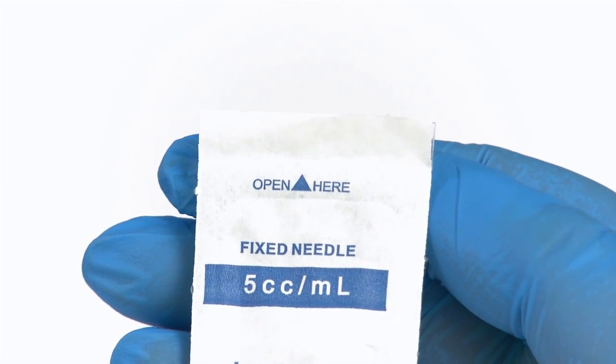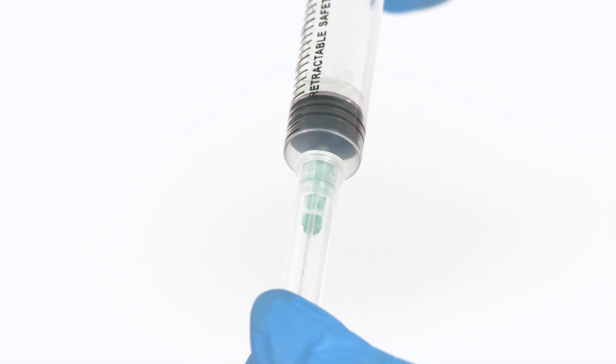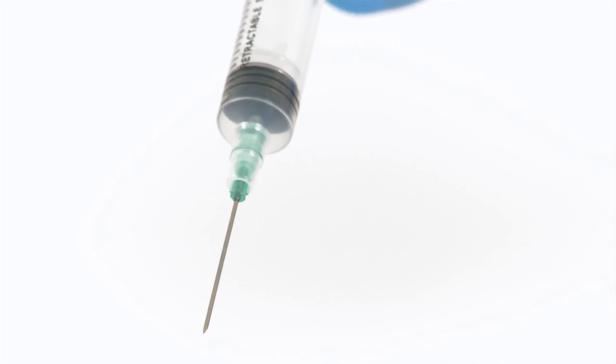Remove the syringe from the packaging as indicated and remove the safety sheath. Perform the injection on the patient.